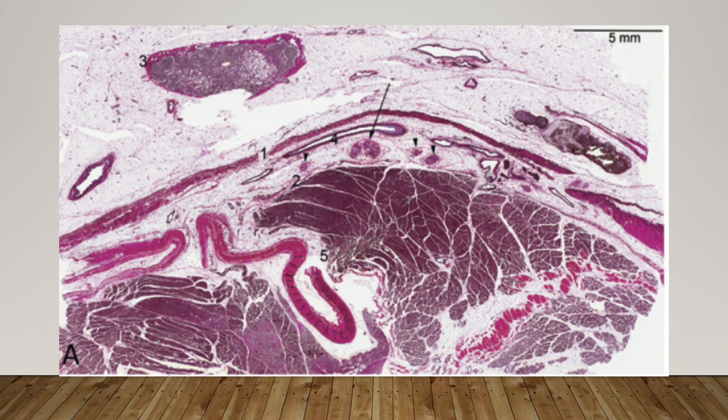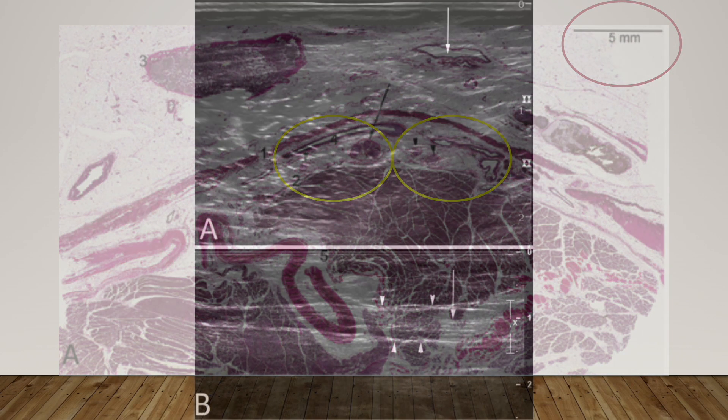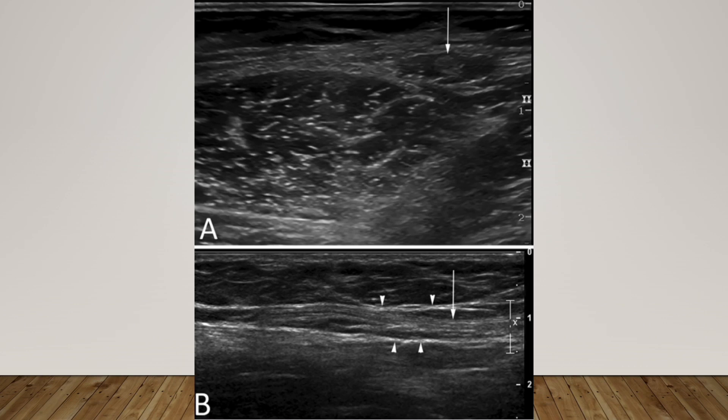Please measure the size of the nerves and neural fascicles. That is why the lateral femoral cutaneous nerve looks like an echogenic structure surrounded by a neighboring hypoechoic fat layer and is little eye-catching.